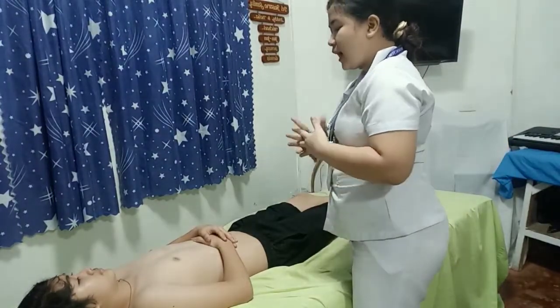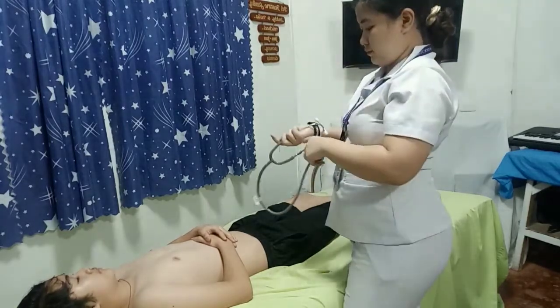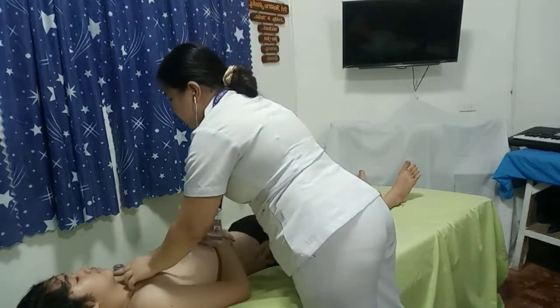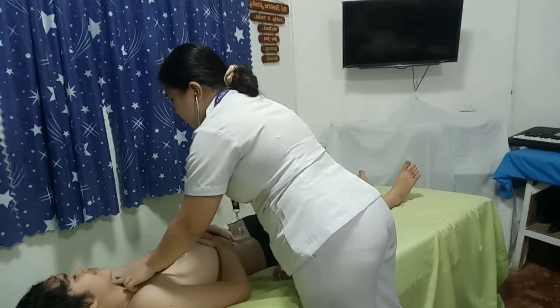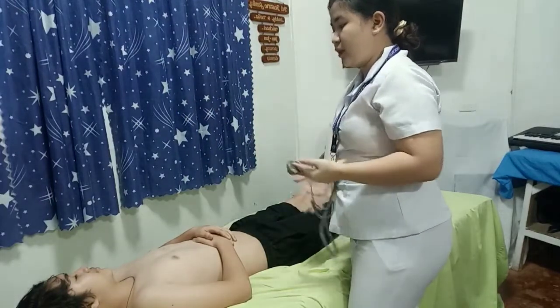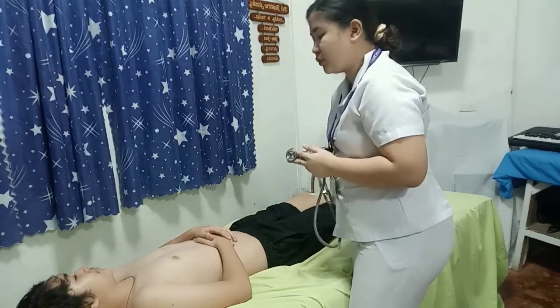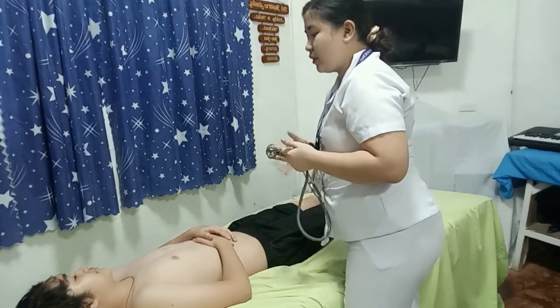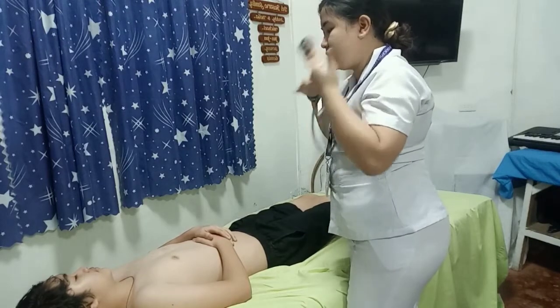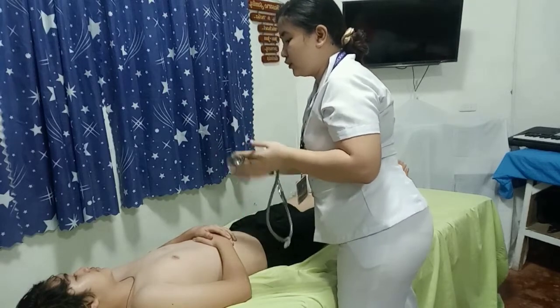Okay, Kevin, I am going to auscultate your trachea first, okay? Okay, so I can hear a high-pitched whistling noise, probably because of the cough that you've mentioned earlier during our history-taking interview. Okay, so now I am going to auscultate the anterior thorax. I am going to place the diaphragm of the stethoscope on your anterior thorax, okay?